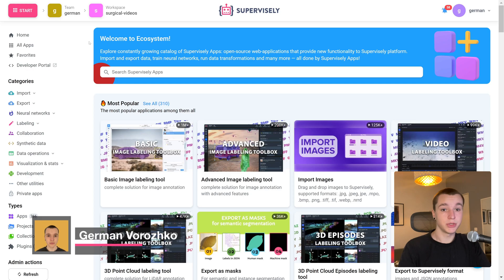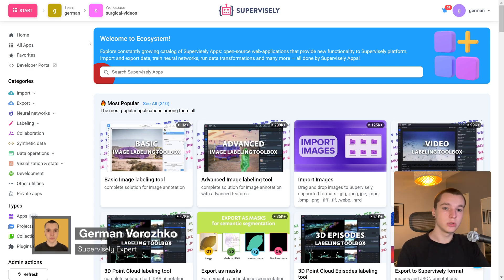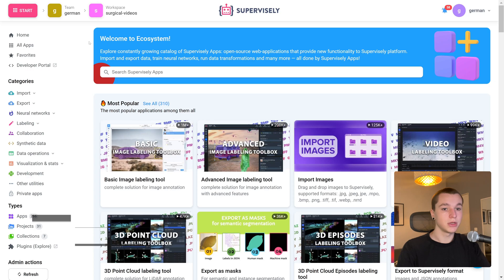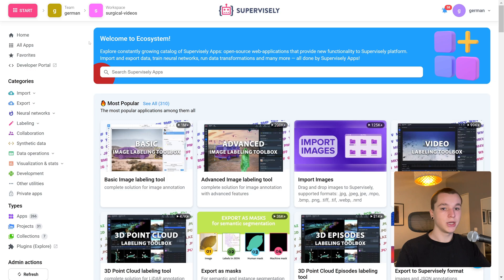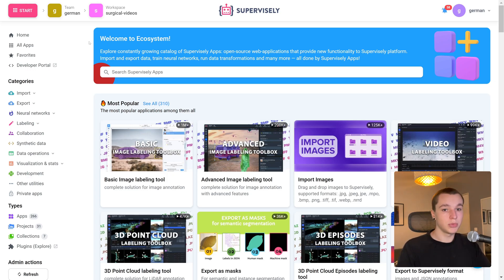Hey guys, Supervisely team here. In this video I'm going to showcase the process of labeling medical videos using neural networks. The showcase will consist of three parts, which are also three annotation types: rectangle, polygon, and masks.